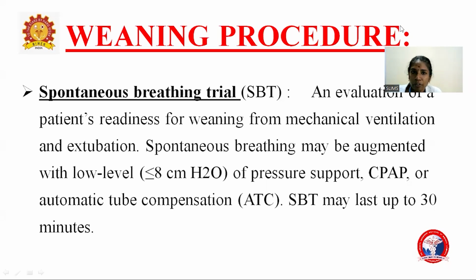Now moving on to the weaning procedures. First comes the spontaneous breathing trial. This is an evaluation of the patient's readiness for weaning from mechanical ventilation and extubation. Spontaneous breathing may be augmented with low levels of pressure support, less than 8 centimeters of water, CPAP, or automatic tube compensation, that is ATC. The SBT usually lasts up to 30 minutes.